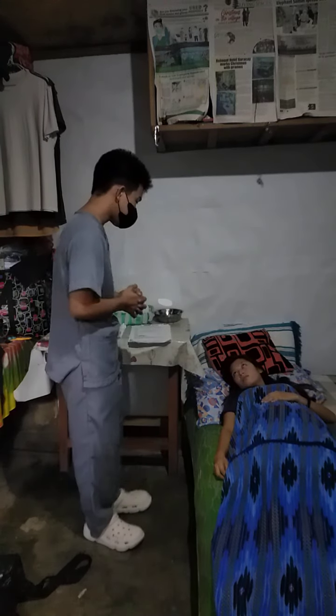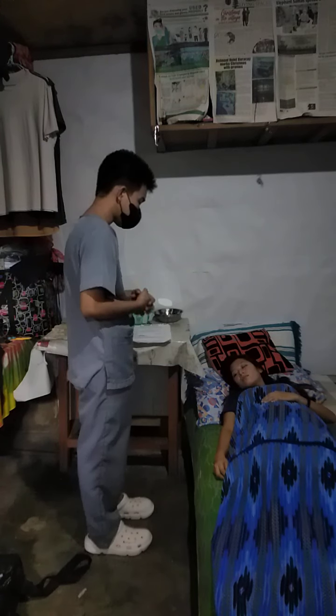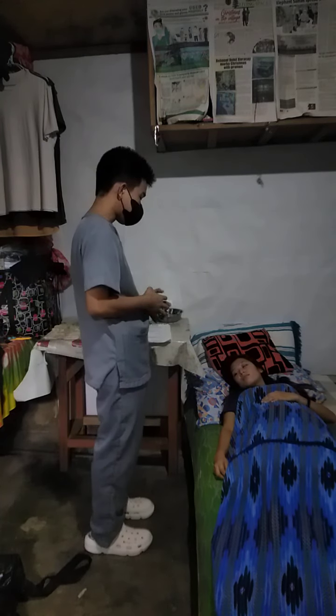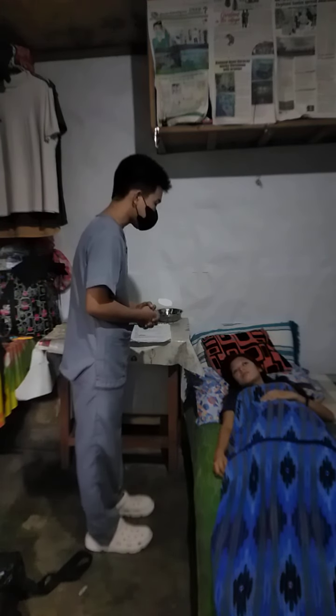So ma'am, may order po si Doc na mag-insert po ng NG tube. Uncomfortable po siya ma'am, pero need po siya ma'am sa condition niyo po ngayon. Makakatulong po siya ma'am para mapadali yung food intake at pag-administer po ng medications po. So, mag-operate lang po tayo mamaya ma'am.